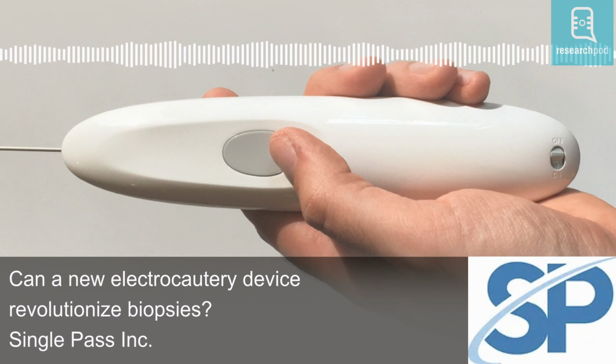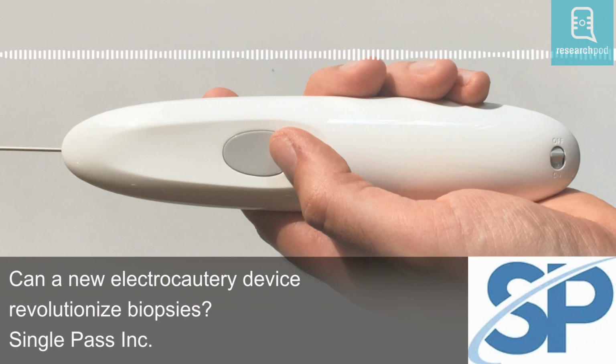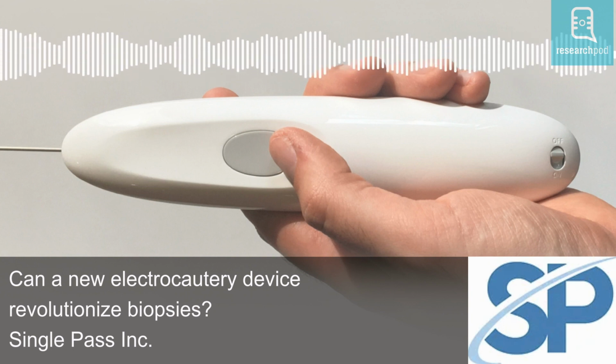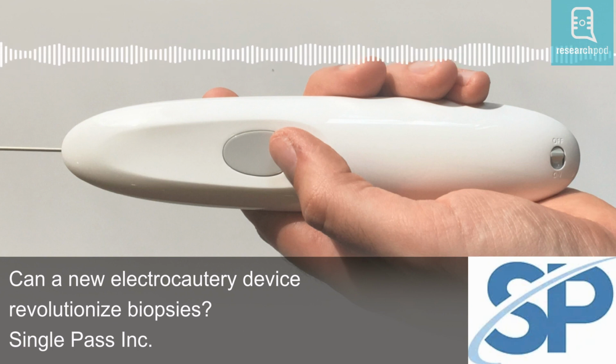But how safe is it? Next, we'll dive into what the latest research data is telling us about single-pass. In the past, the single-pass device has been through bench tests to determine its mechanical durability, as well as animal tests, where blood loss was used as a key marker for safety. Results were positive, so the focus has now shifted onto human applications and safety.